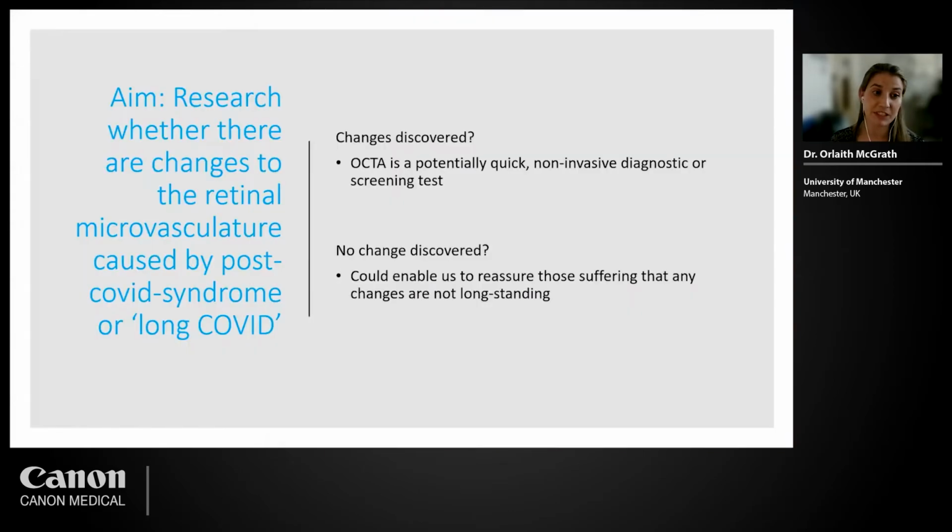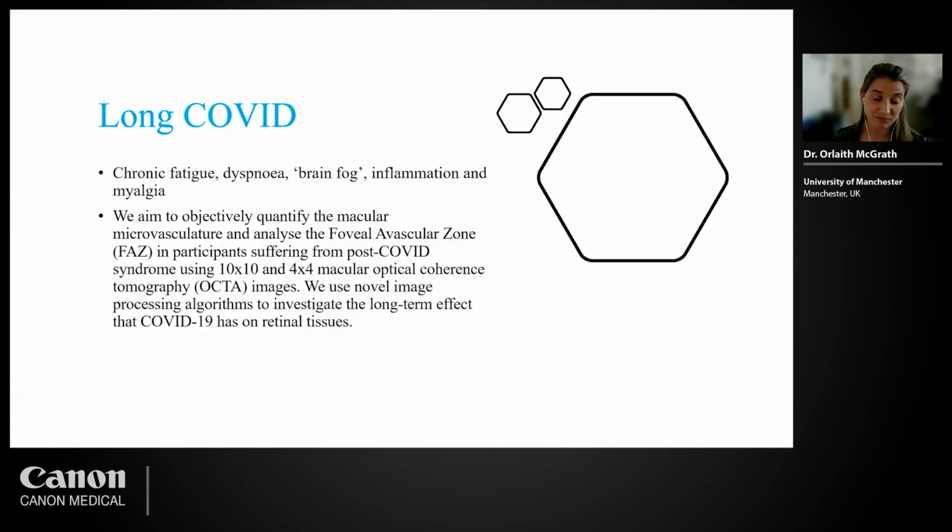So the aim of our research today was to figure out whether there are any changes to the retinal microvasculature caused by post-COVID syndrome or by long COVID. Our thought process was that if there were changes discovered, then that could say that OCT-A is a potentially quick, non-invasive diagnostic or screening test. And if we don't discover any changes, it could enable us to reassure those suffering that any changes are not actually long-standing. While the pandemic may have calmed, it has left millions suffering in its wake.